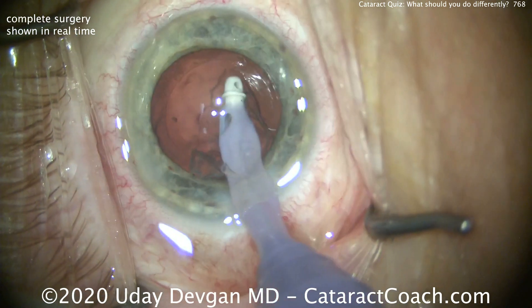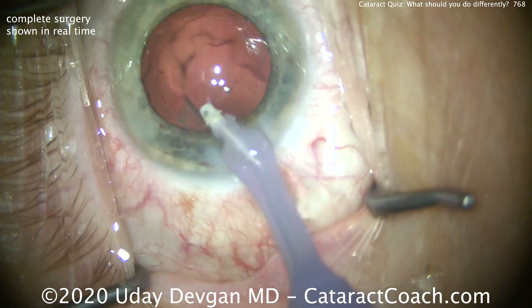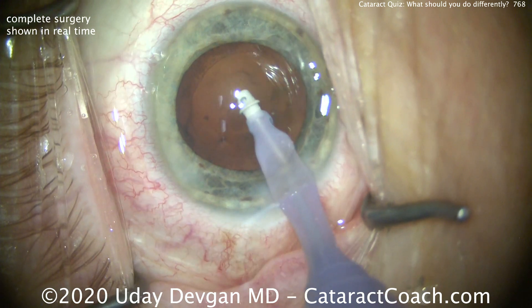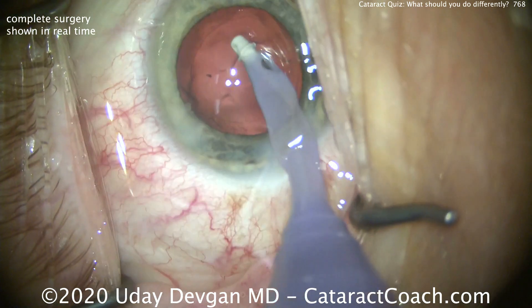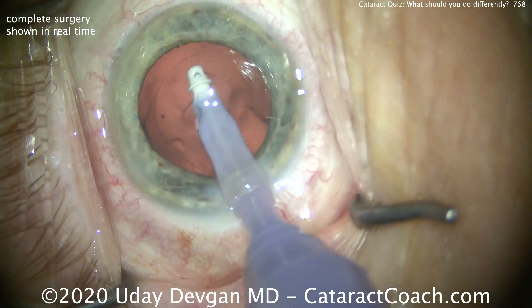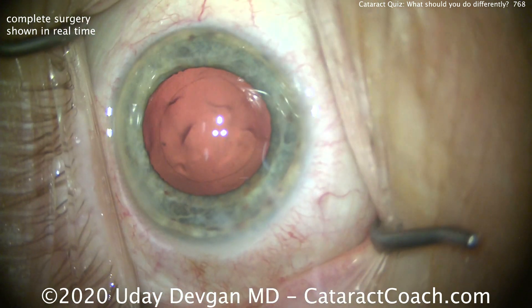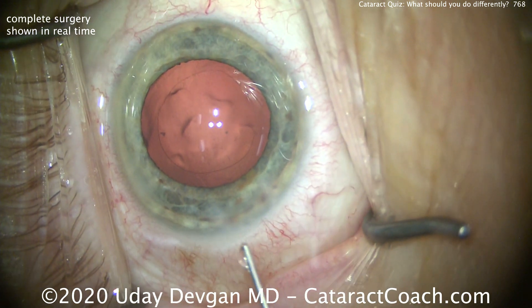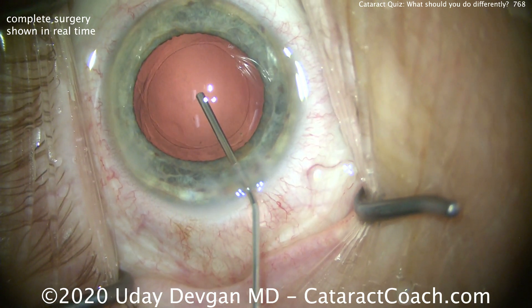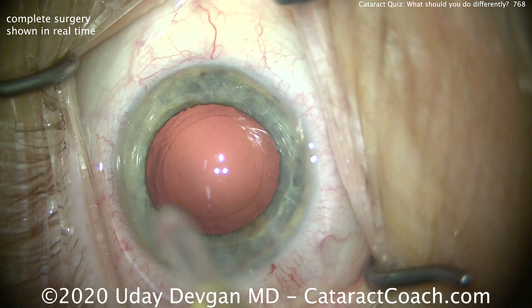We're cleaning up the capsular bag. Let's talk about IOL power. If you're planning to do a DMEK surgery later, that can cause a bit of a refractive shift, so you may want to leave the patient on the myopic side — aim for at least minus a half as a post-op result instead of plano. This patient has been a lifelong low myope and wishes to retain that myopia, about minus 2.25 for life, so we're going to leave the patient at about minus 2.25 per their request.